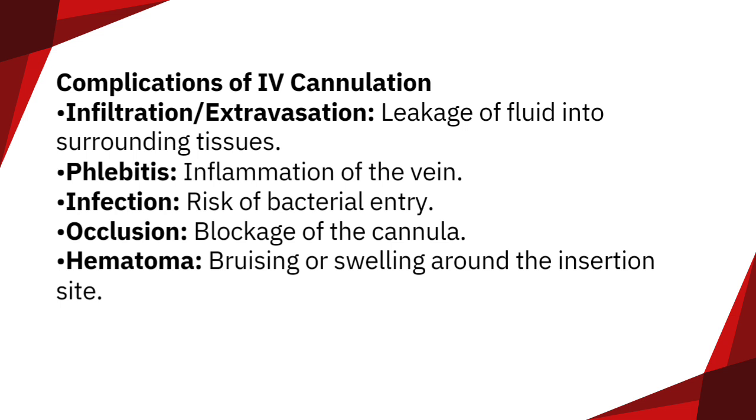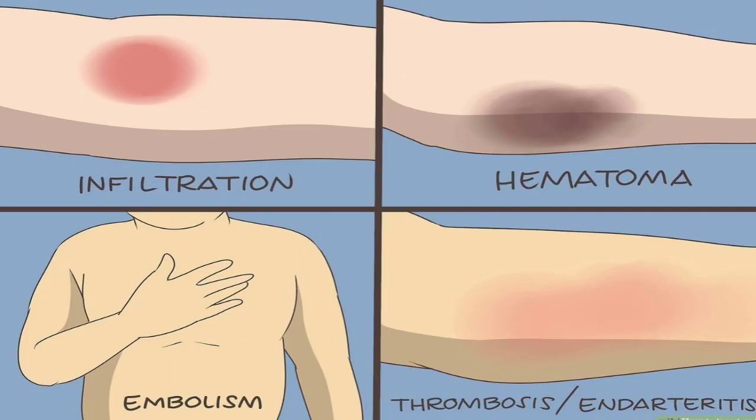Complications of IV cannulation. Infiltration or extravasation. Leakage of fluid into surrounding tissues. Phlebitis. Inflammation of the vein. Infection. Risk of bacterial entry. Occlusion. Blockage of the cannula. Hematoma. Bruising or swelling around the insertion site.